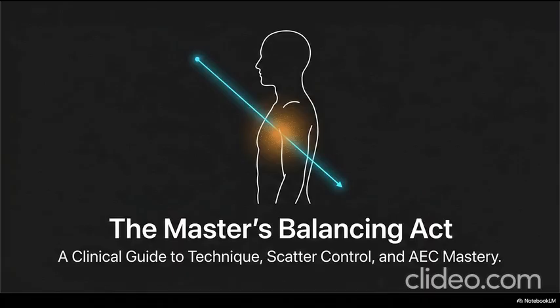If mAs is how many photons there are, kVp determines how powerful they are. Yes, it controls the beam's energy, its ability to actually penetrate through the body, and ultimately it controls the contrast of the final image. Because you can create 1 million photons with your mAs, right? Right, but if they don't have enough kinetic energy behind them, which is what kVp provides by increasing the electrical potential difference across the tube, they will just get completely absorbed by the patient's skin and superficial tissue. They just get stuck. Exactly. They will never penetrate all the way through the body to reach the digital detector on the other side.